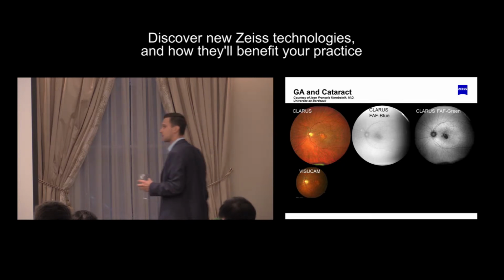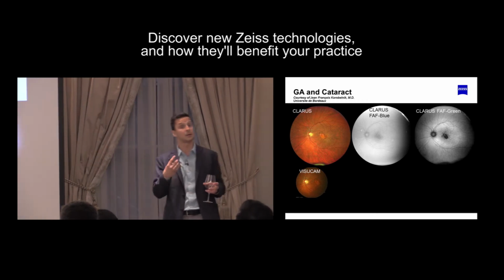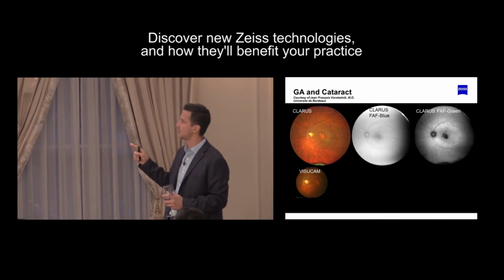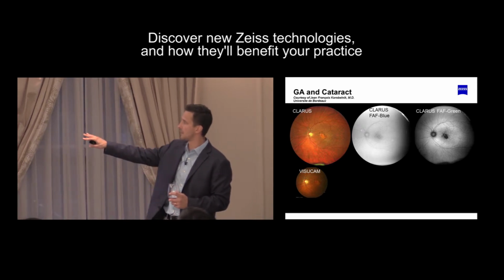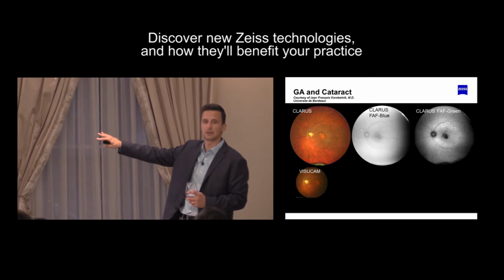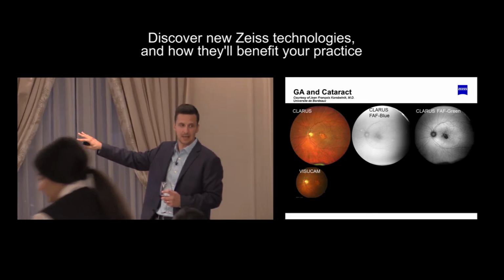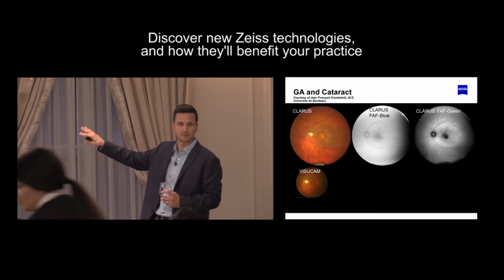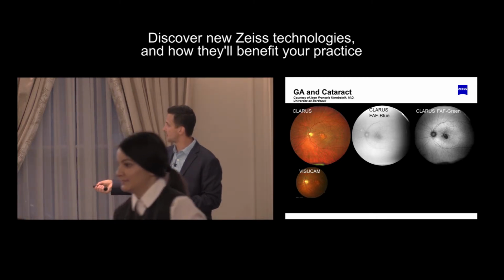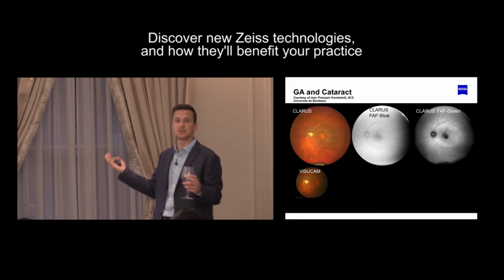I put up geographic atrophy and cataract here because I think this is another important one. If we're looking at cataracts moving from 1.5 million to 3 million in the population, we have to keep in consideration that you sometimes are going to run into patients where it doesn't matter how good your image was, you just can't get a really good light source in there to image the retina. So something like Blue Peak falls down here because Blue Peak is affected by that cataract. Whereas when you are looking at the geographic atrophy right here on a FAF green, you don't see any distortion. If I blew that up, that would be just as high a quality.